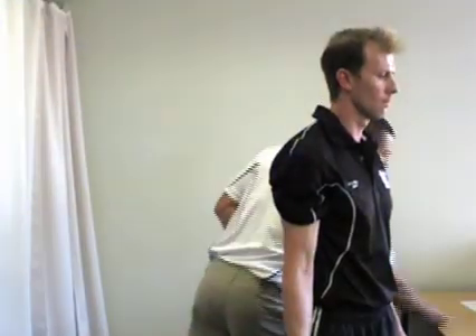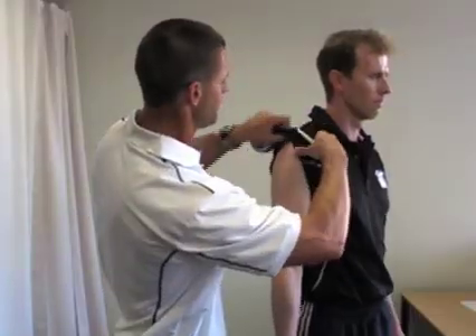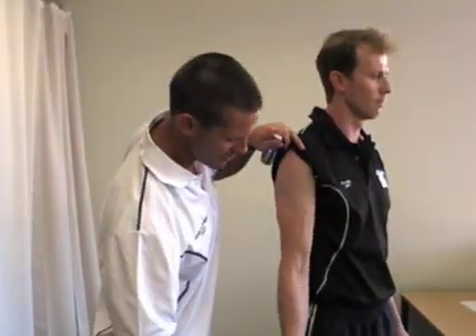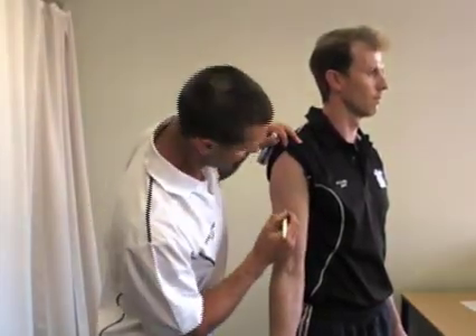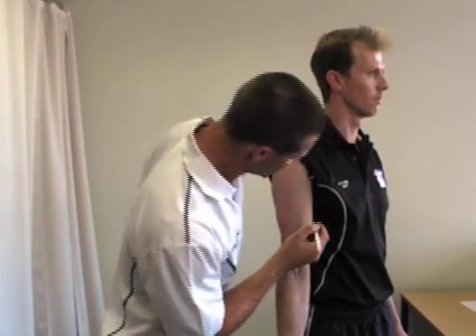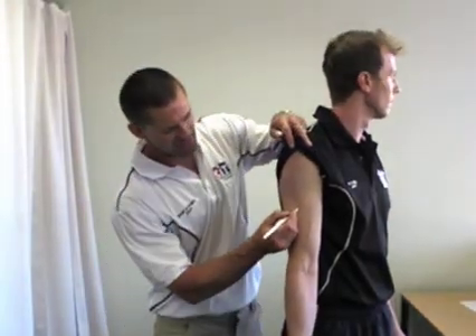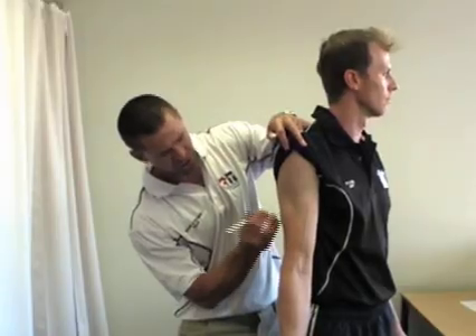What we simply want to do now is rule a line across to the actual bicep, so we'll get Simon to go to the anatomical position with his palm facing out. We're going to take the line across and make a cross on the front on the bicep muscle. We'll also take a similar line across the back and make a mark on the triceps.